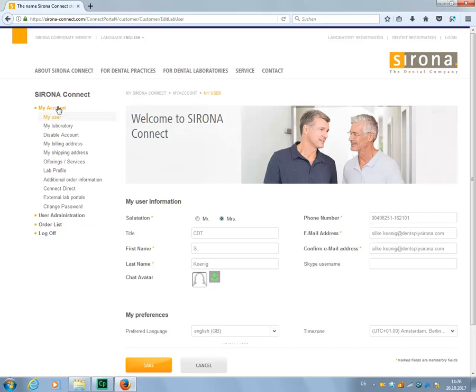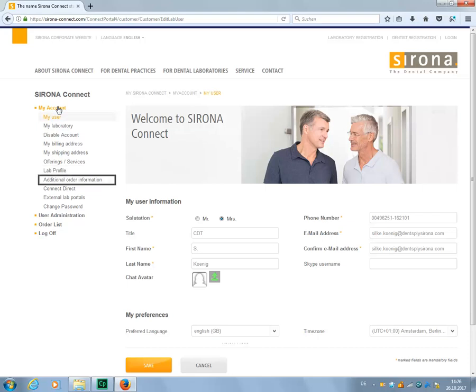In this tutorial, we will be focusing on two of the submenus. First, we will look at the lab profile. Then we will take a closer look at the additional order information.